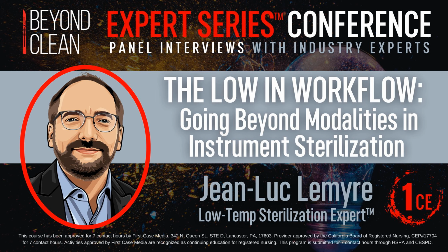So we would love to see at Beyond Clean a bigger emphasis in the industry on low temp sterilization education going to technicians, the practical aspects of how it works in the chamber, what we're doing. Because whenever you understand those things, whenever you have a good grasp of the importance of something, it tends to drive home compliance a little bit better. So maybe people would understand a little bit more clearly why it's important to have those instruments bone dry, or have the instruments be rinsed very, very well to make sure that there's no residual detergent on there, because they know the risks of what can happen, because they understand what goes on in their sterilizer.